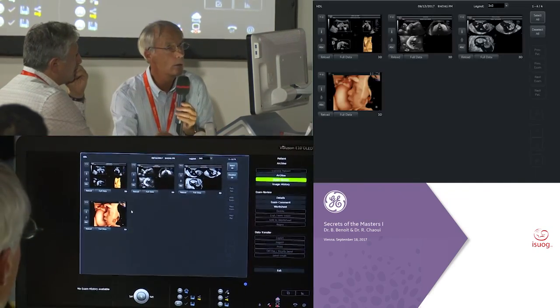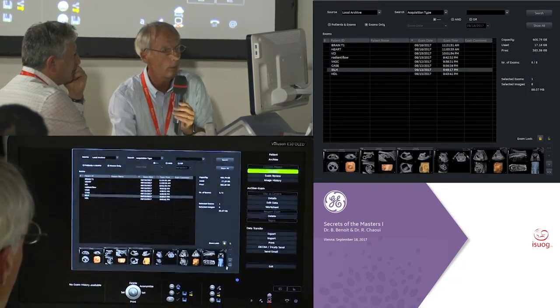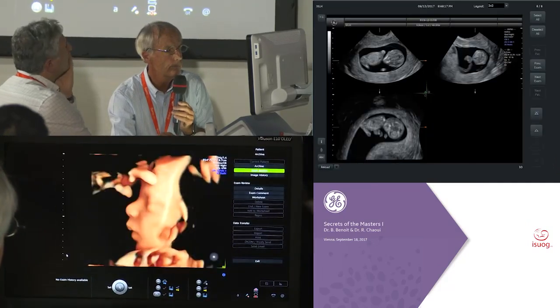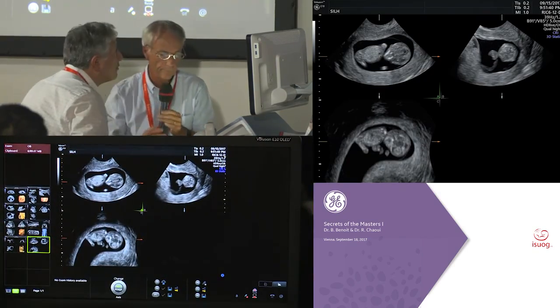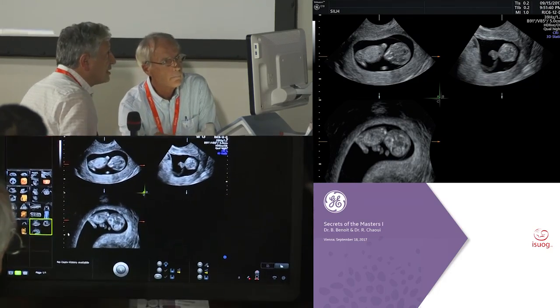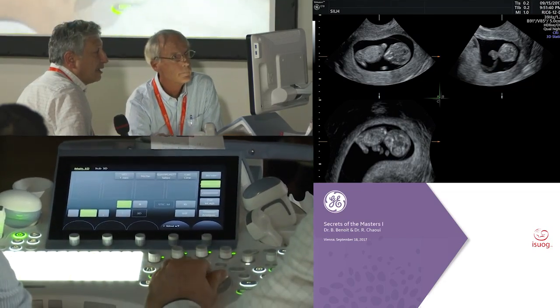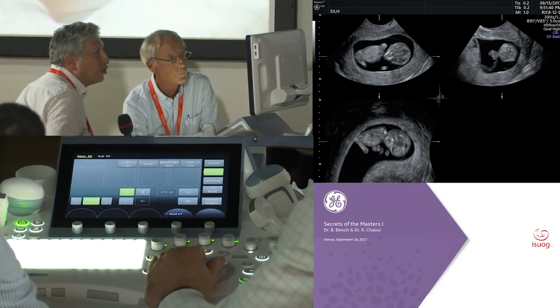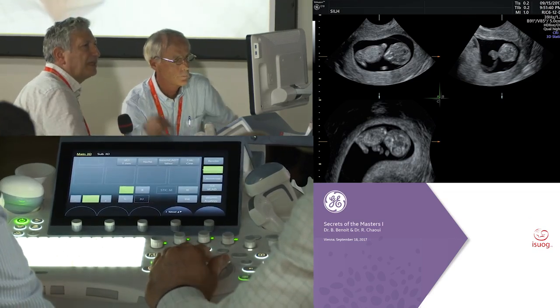We will take first trimester. So this is the first trimester volume. First of all, I want to emphasize that you should always try to have a large volume. Especially if you want to be close to the fetus, you may push a little bit here, and the uterine wall may touch some of the limbs, and it's really difficult to remove.